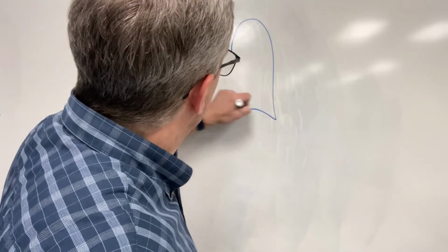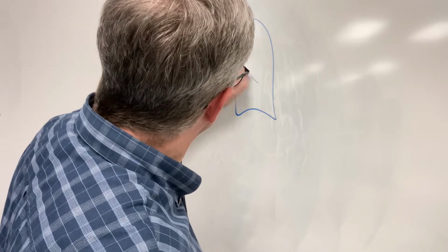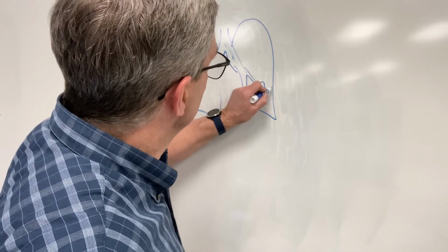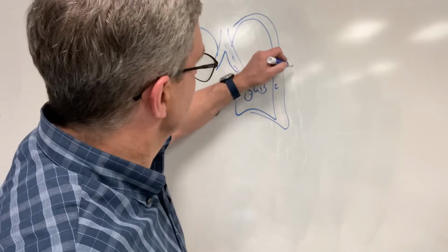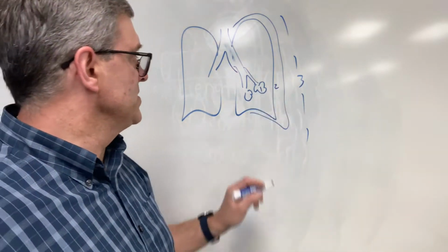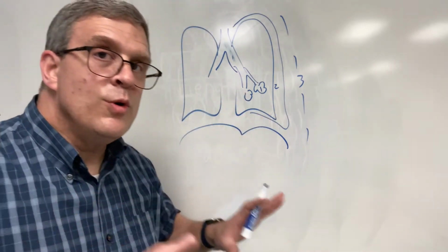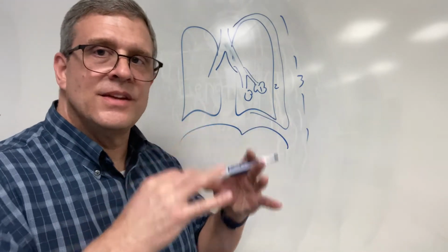So we have the airway resistance, which is going to be in the airways, the resistance to airflow. And then we have the things that the vent has to push against. Those were our three areas: the gas exchange units, the pleural space, and the chest wall, which includes things down here, remember, in the abdomen. So when the ventilator pushes that breath in, there's moving air. It's got to push through the airway resistance and the compliance, the stiffness of the lung.